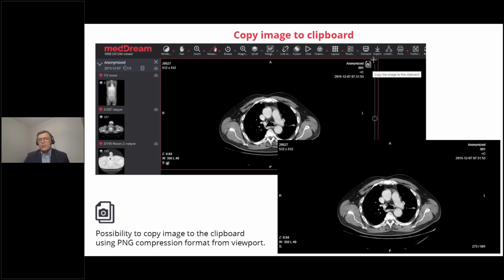This function is also useful if some partners would need server-side implementation, so by copy you would send it to another information system. It still requires some updates and some work on it. But now, because the engine itself is new, this R&D customization work would not be significant like in the past. So I really recommend for all of you, if you're facing this need, to contact your dedicated person in Softneta and get your estimations on the needed changes, because I believe this is now not so significant.